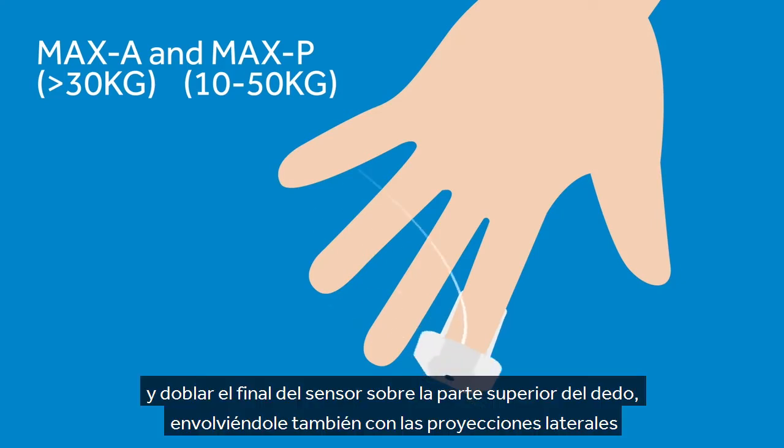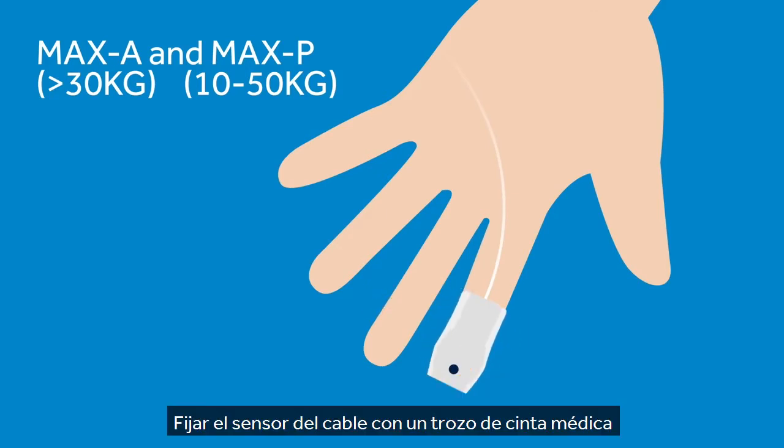Fold the cable end of the sensor over the top of the finger. Wrap the adhesive flaps around the sides of the finger. Anchor the sensor cable with a piece of medical-grade tape.